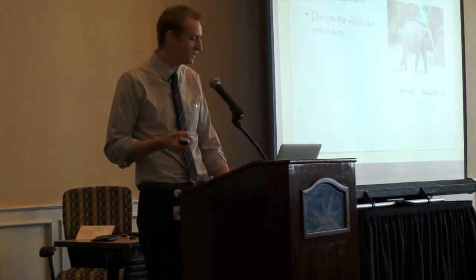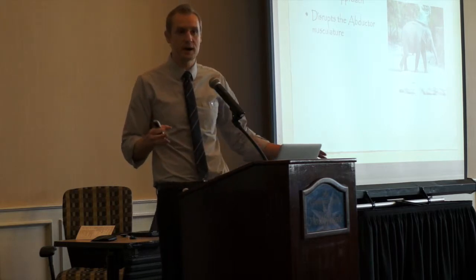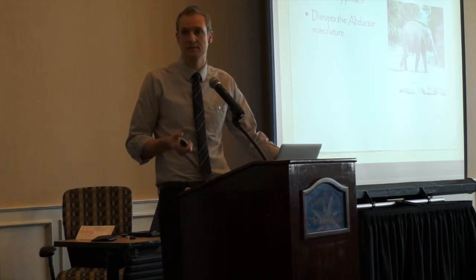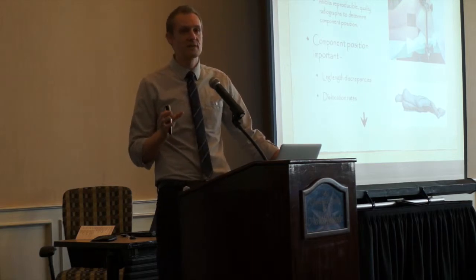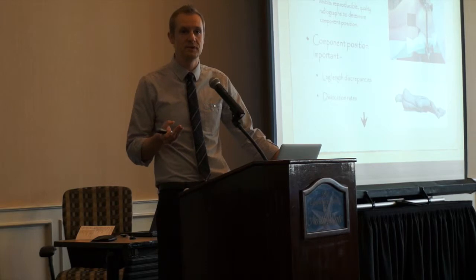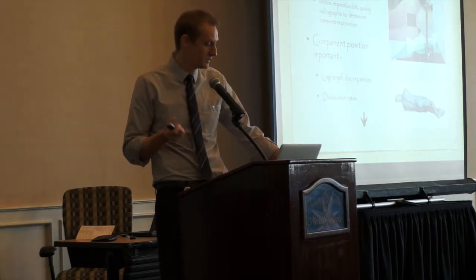The lateral and anterolateral approaches come from the side. Obviously it's not as popular an approach, as we already discussed. It does disrupt the abductor musculature around the hip. Traditional approaches all have the patient positioned on their side, so the operative hip is facing up towards the ceiling, as visualized in the two pictures on the side.